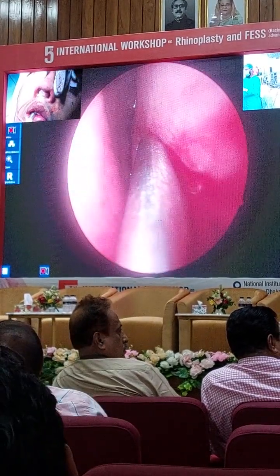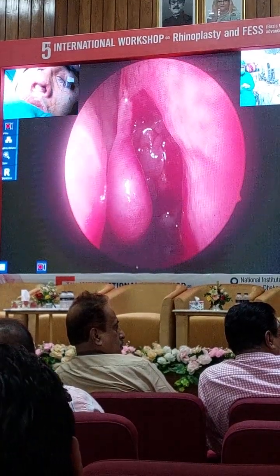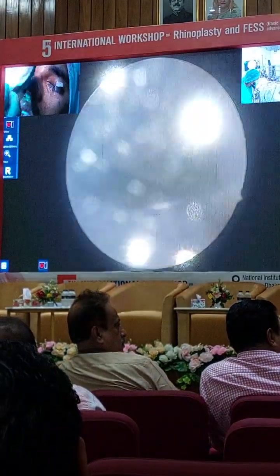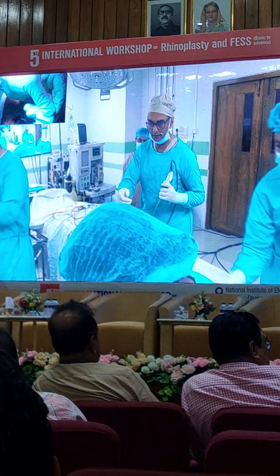Now I'm going to come anteriorly and see what we have anteriorly. Give me a right angle curette. Where are my instruments? Yeah, this is a right angle curette. Correct, do that.